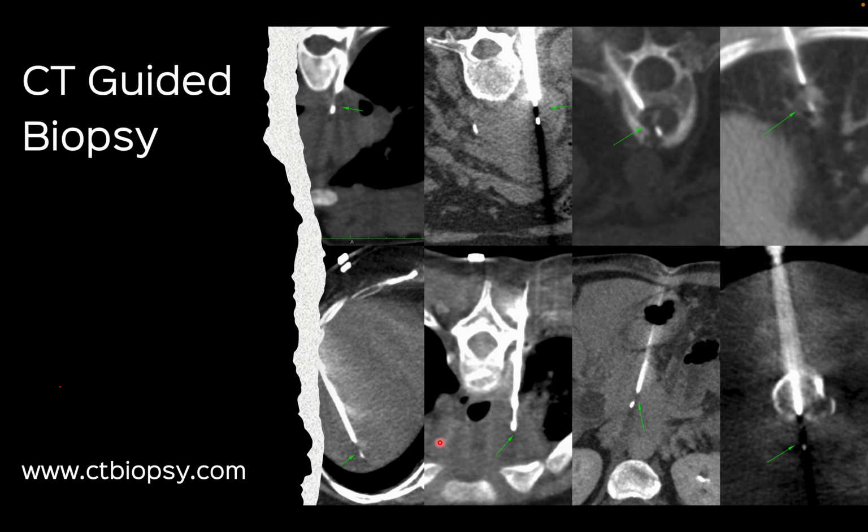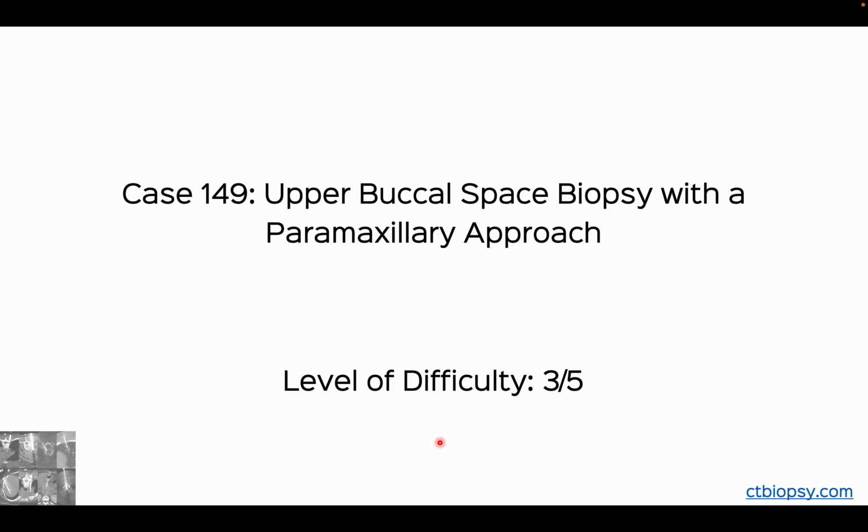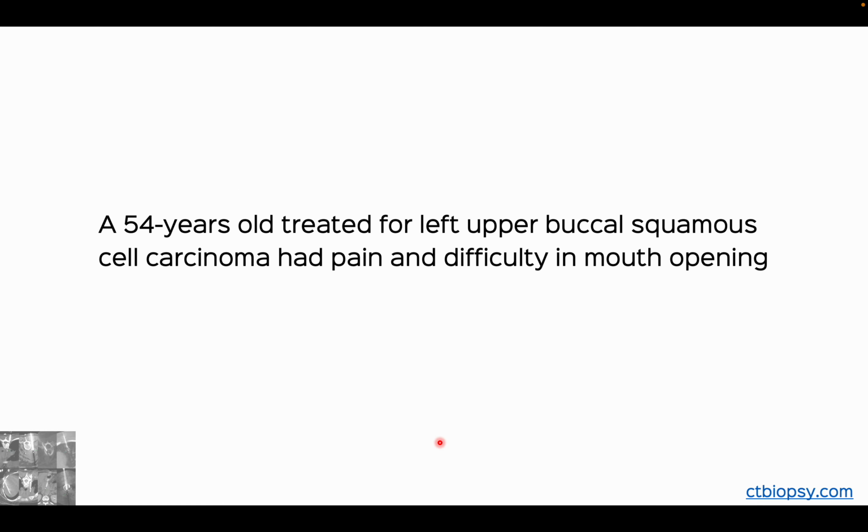This is Dr. Bhavin Jankaria, and here we have the 149th case, an upper buccal space biopsy using a paramaxillary approach. Now, the level of difficulty would be 2 by 5 or 3 by 5, depending on your expertise and experience, but really not more than that.